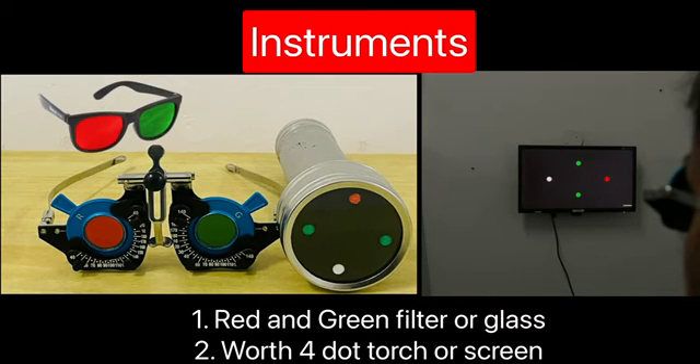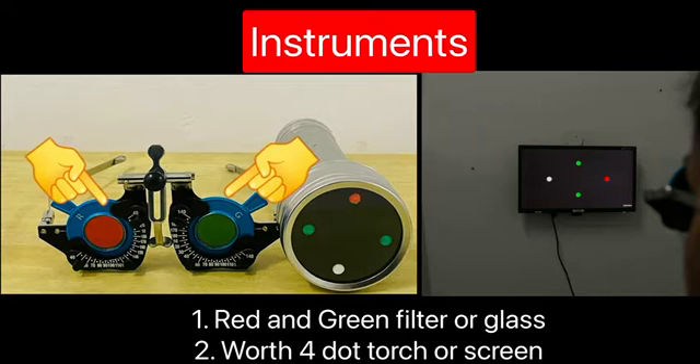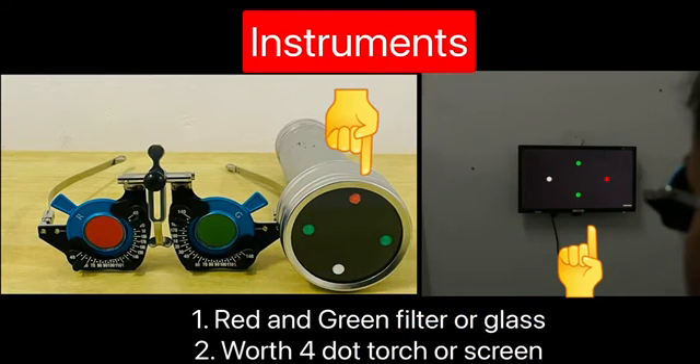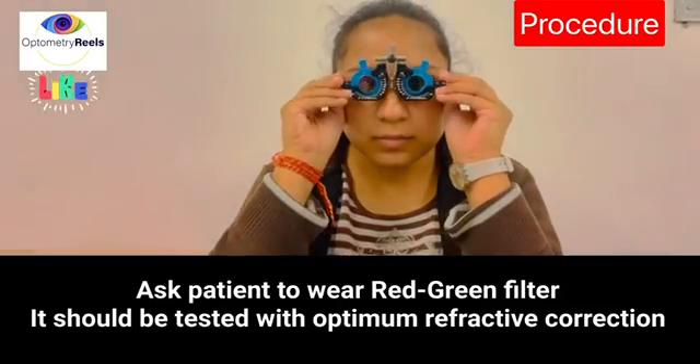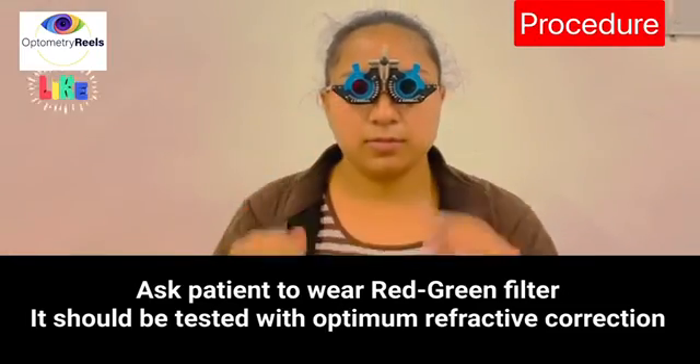To perform the test we require red-green glasses, known as anaglyphs. You can also use red-green filters present in the regular trial set. The other requirement is a Worth 4-Dot screen or torch, which should contain four lights as shown on the screen. Make your patient wear the red-green glasses.